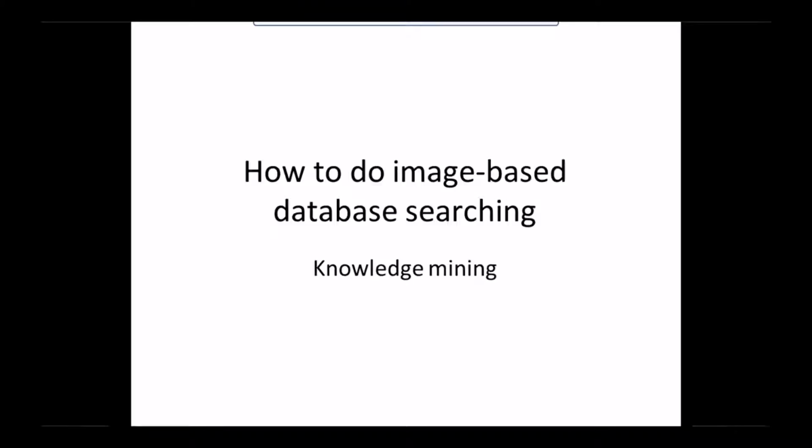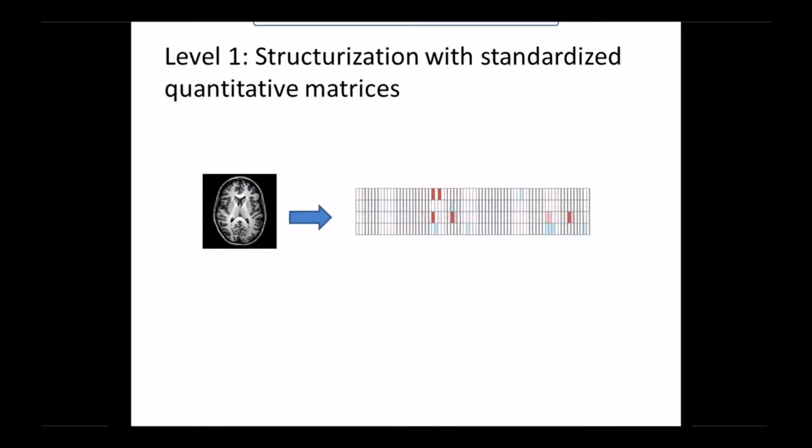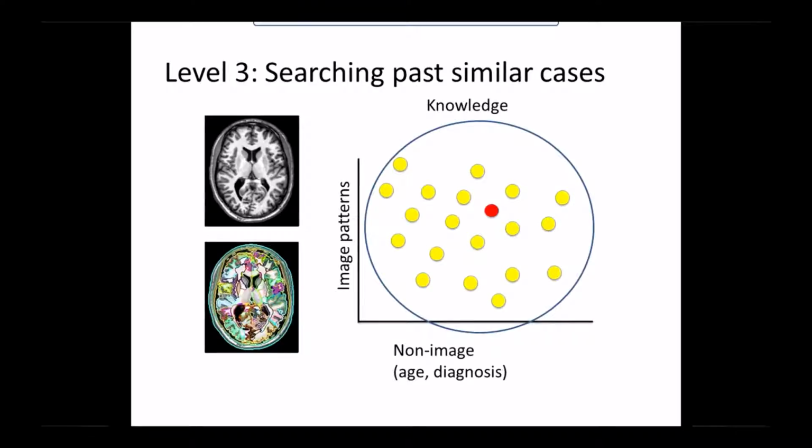Now it's pretty clear that we've reduced these images to an index on which we can do all of the classic machine learning that's being developed in the world, and we're doing that. You can think of that as knowledge mining. We have a large team of radiologists working on annotating the clinical record. We have collected about 7,000 or 8,000 pediatric cases through our radiological workflow, and they're being annotated for about 100 diseases that kids have that bring them in through the pediatric MR neuro clinic. We also have a huge geriatric collection; we're a major site for study of various dementing illnesses.